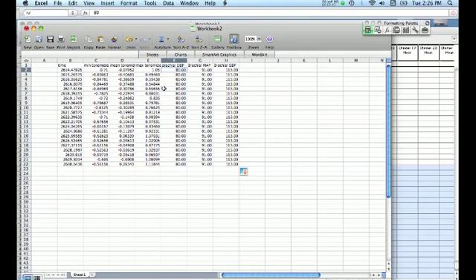Now there are a couple assumptions that we make. One is that in the supine position, diastolic and mean arterial pressure in the brachial artery is similar in all other large arteries. So in other words, this particular value is equal to 80 and this particular value is equal to 91. But systolic blood pressure differs and becomes augmented, or gets larger, as you move out into the periphery.